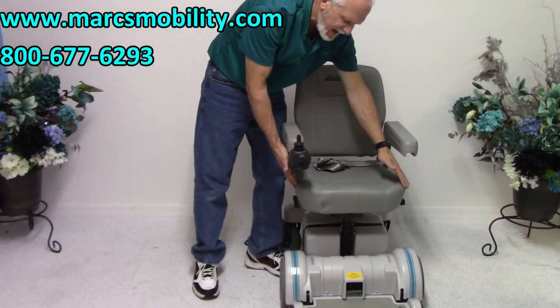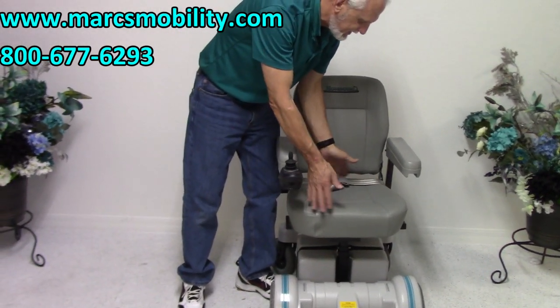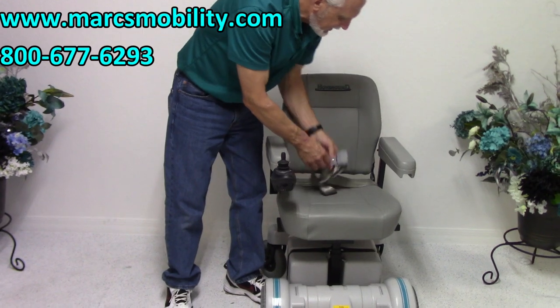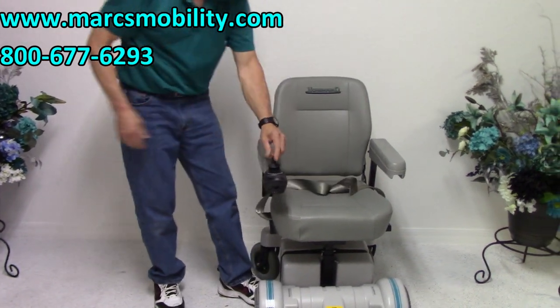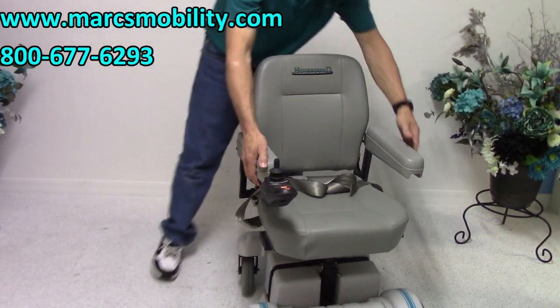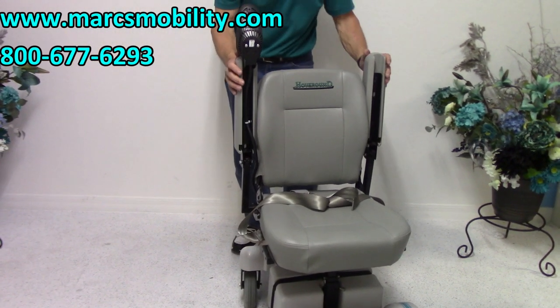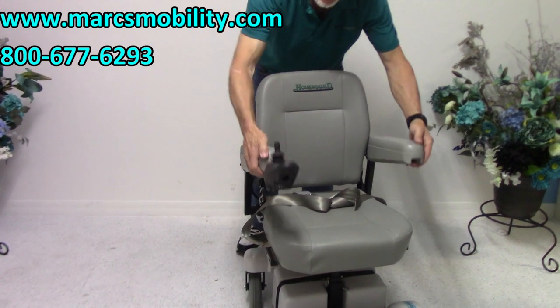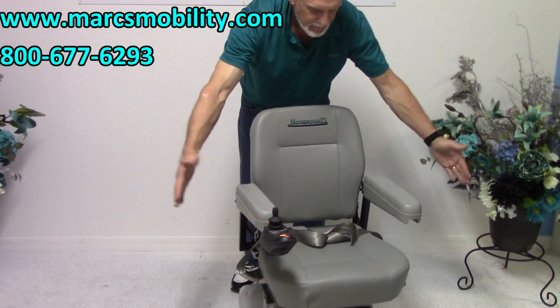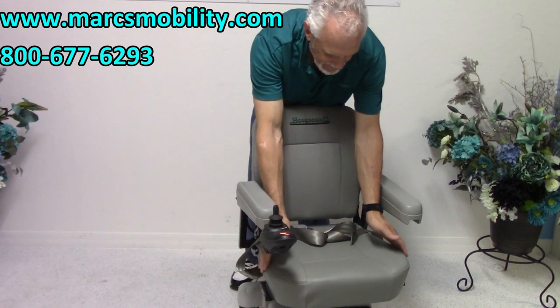You've got a seat on here that's 18 inches wide by 17 inches deep. You've got your heavy-duty safety belt. You have adjustable arms — they flip up, and if you need more width, they also go out and can be tipped. Your seat is 18 by 17.